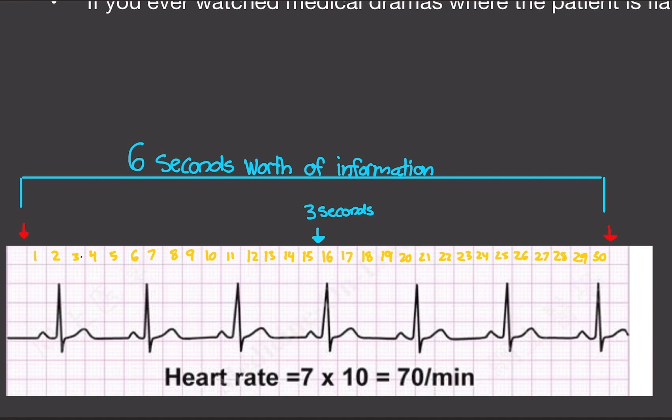Heart rate is measured in minutes, or beats per minute, or 60 seconds. So all you have to do is count up the number of spikes you see in 30 boxes, or six seconds, and that's your heart rate. We see one, two, three, four, five, six, seven — seven spikes for six seconds. Multiply by 10 and you get 70 beats per minute, which is normal. Normal heart rate is from 60 to 100 beats per minute.